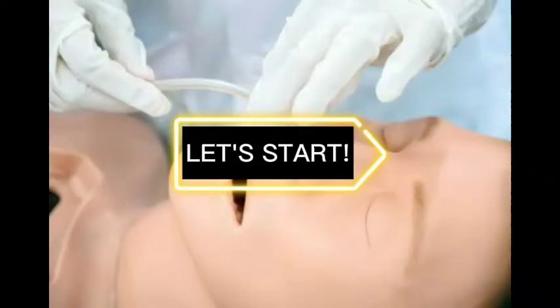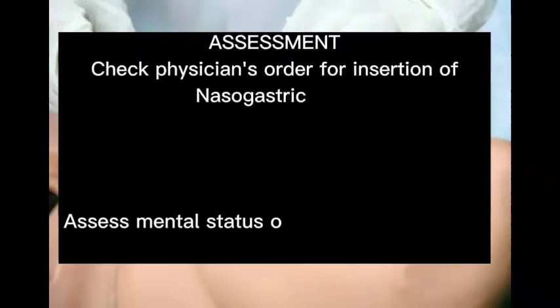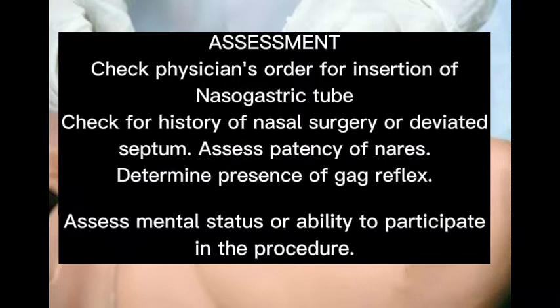Let's start! Assessment. Check physician's order for insertion of nasogastric tube. Check for history of nasal surgery or deviated septum. Assess patency of nares. Determine presence of gag reflex. Assess mental status or ability to participate in the procedure.